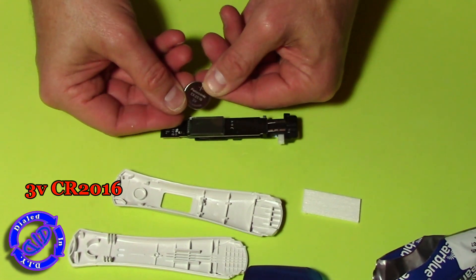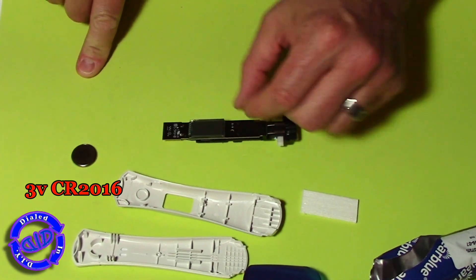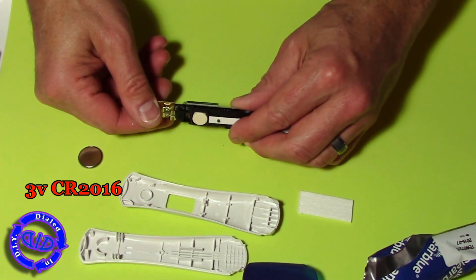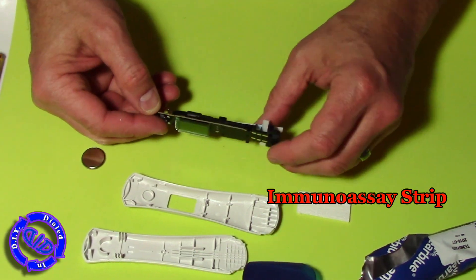The key thing that falls out here is this nice little 3-volt battery. Since this barely needed to be used for anything, that battery is fresh and new and ready for another purpose.